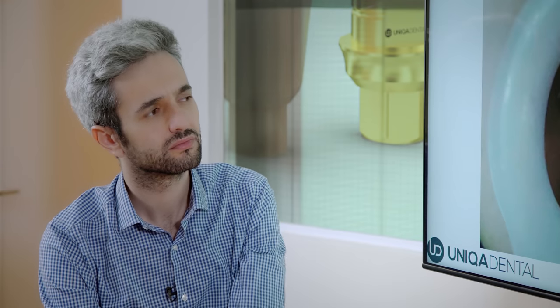You can see the pigmentation, you can see that the periodontal health of those teeth is not the best. We made some x-rays, we checked the teeth — the teeth need to be extracted. They are hopeless, you can't do anything really good for these teeth. What we're going to show is how we made all the procedure while leaving the patient with a temporary bridge that they can have some function with, and not a denture or something like this.